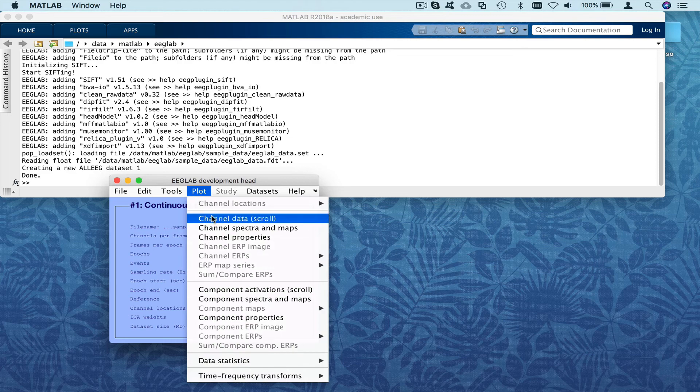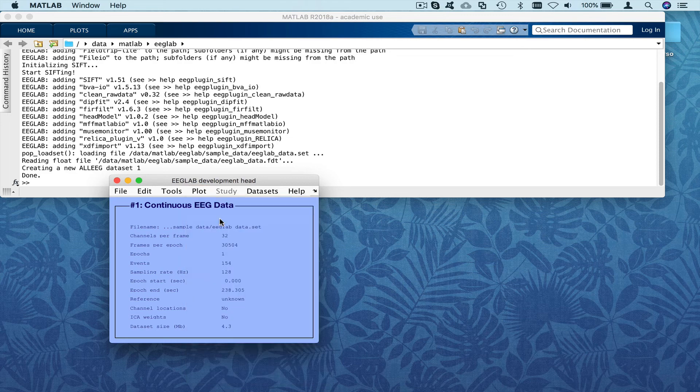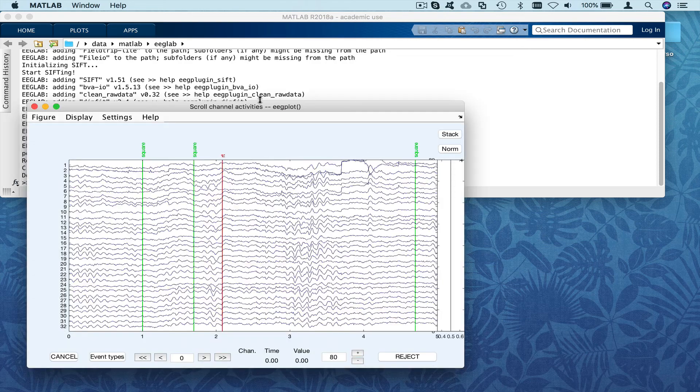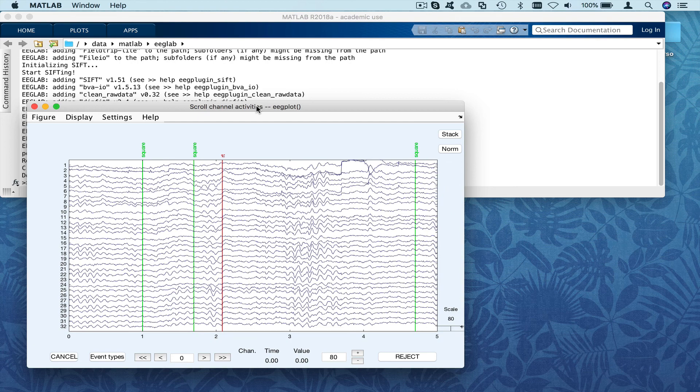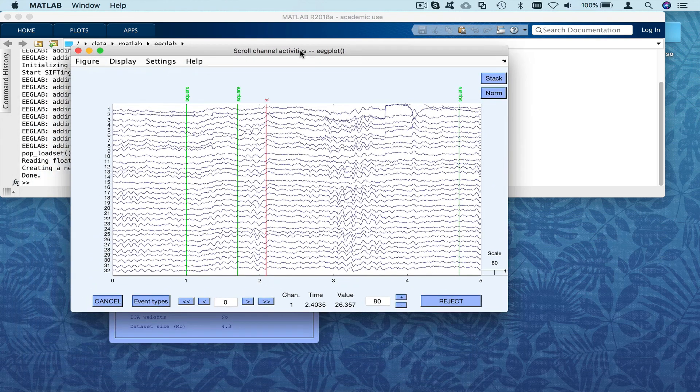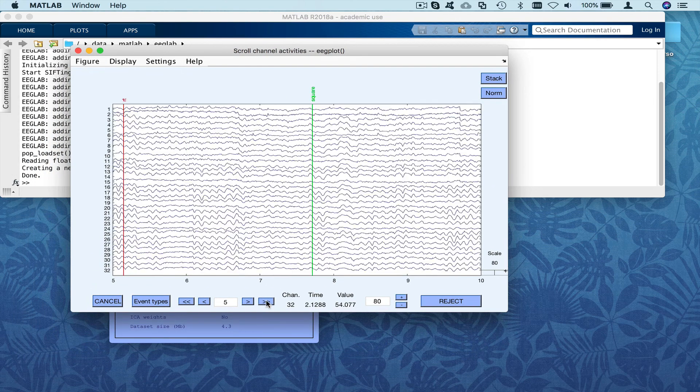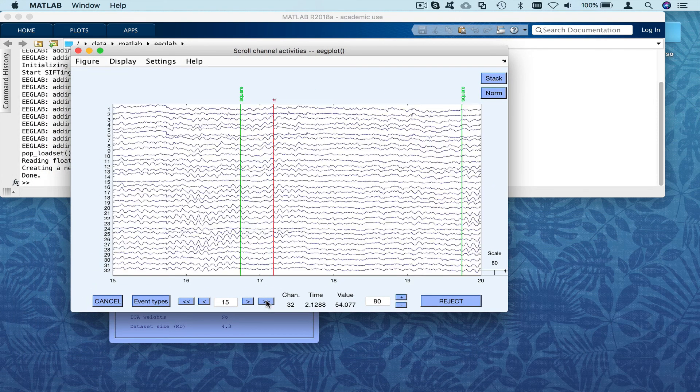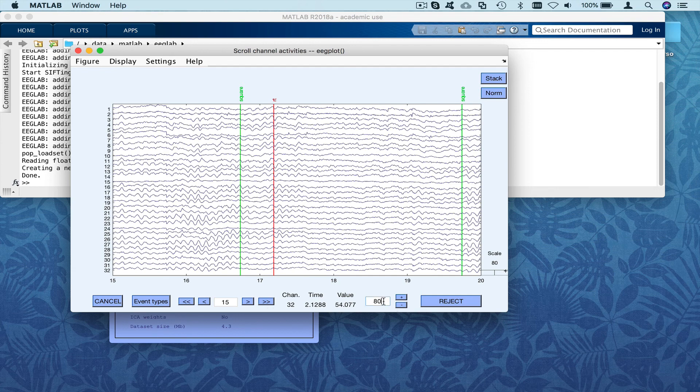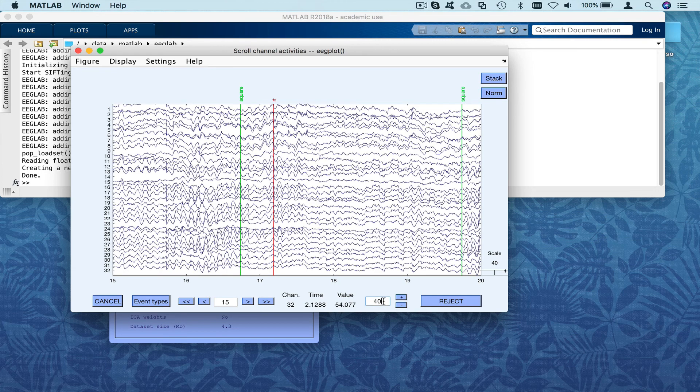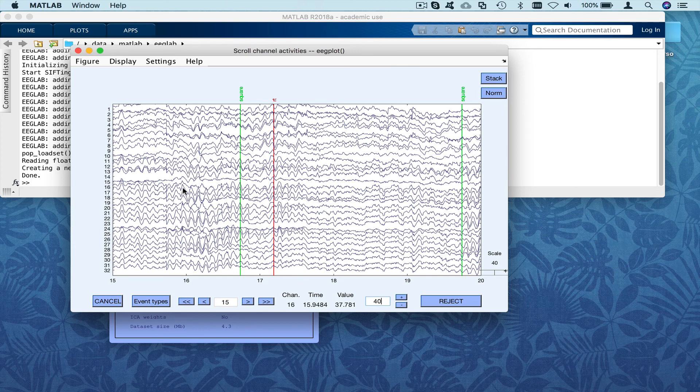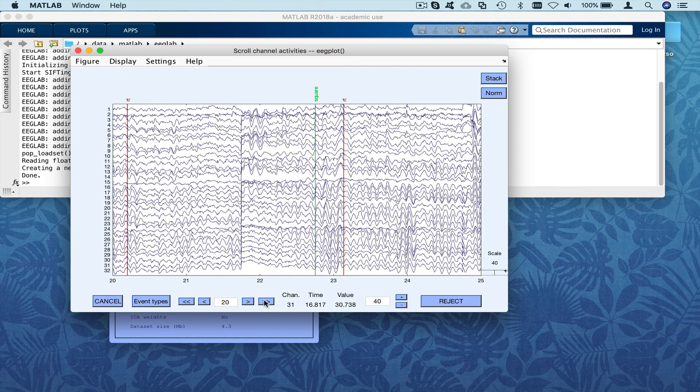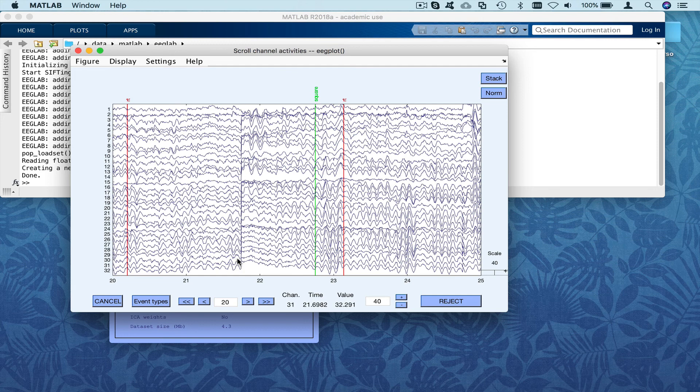I'm going to use this menu, plot, channel, scroll data, and so we can move forward. We can change the scale here, for instance, so here we see nice alpha rhythm, there's not much artifact. There's one artifact here, a strong discontinuity in this signal.